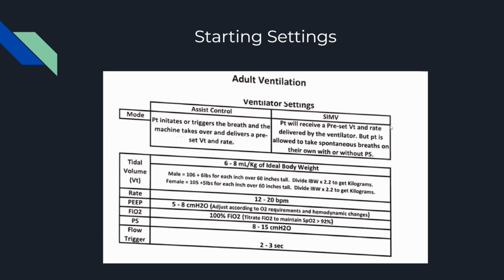Okay, so next let's start talking about some settings. So this, and you'll notice it's a fairly bad image of this. That's because it's laminated and I had to get it from a weird angle not to get a glare. But this is a sheet that is hanging off of the ventilator in the ER. It is baseline settings where if you put these settings in, you won't kill anybody. Okay? It'll work. And then you can tweak them from here, but this is your starting settings, okay?